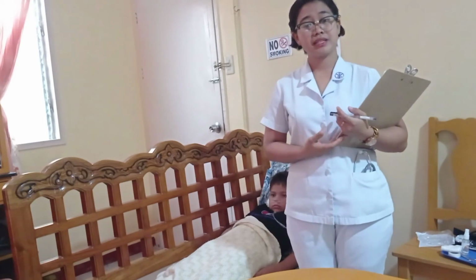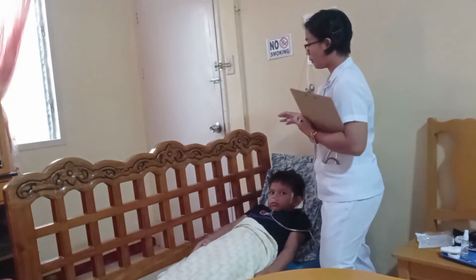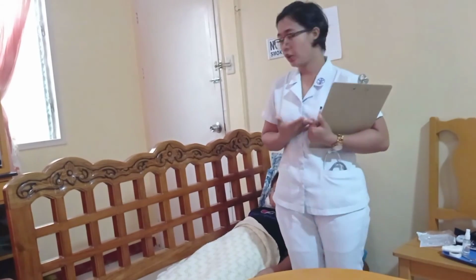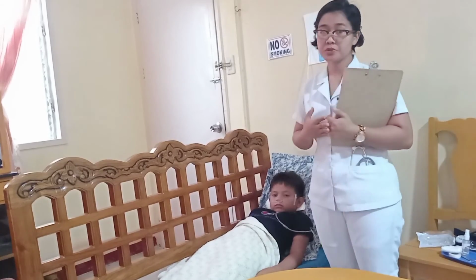Next, I am going to inspect the equipment on a regular basis by checking the liter flow and the level of water in the humidifier every 30 minutes and whenever providing care to the client. I am going to make sure the safety precautions are being followed. The patient and the significant others are following the no smoking premises.